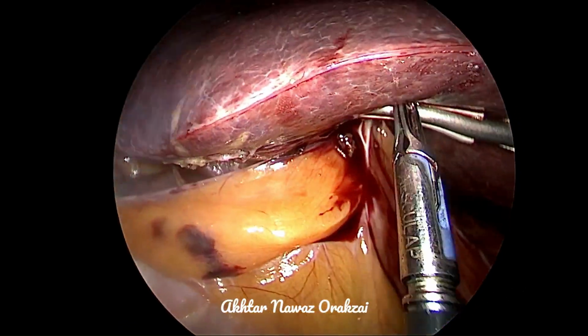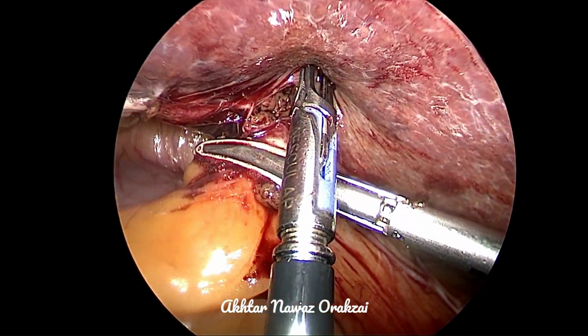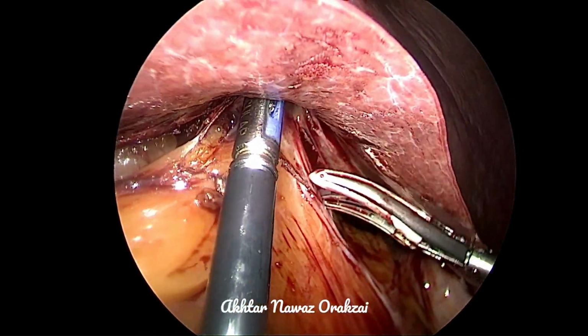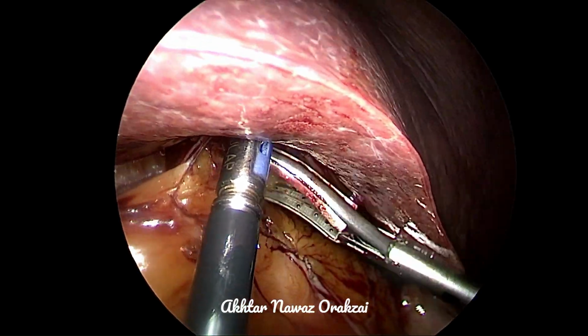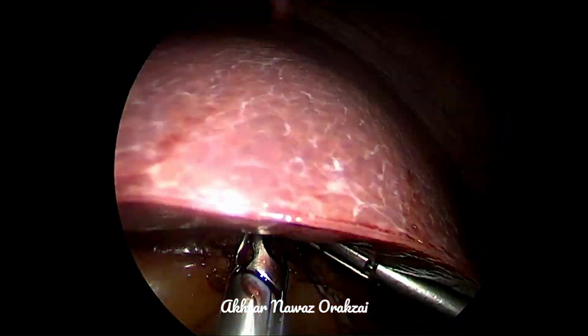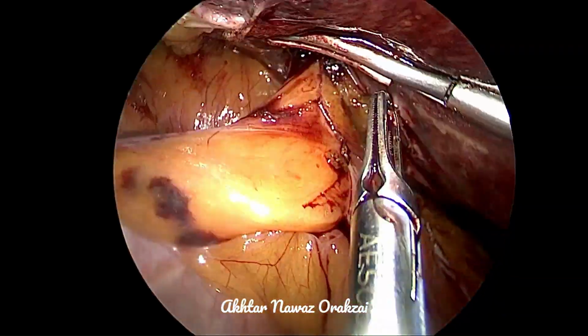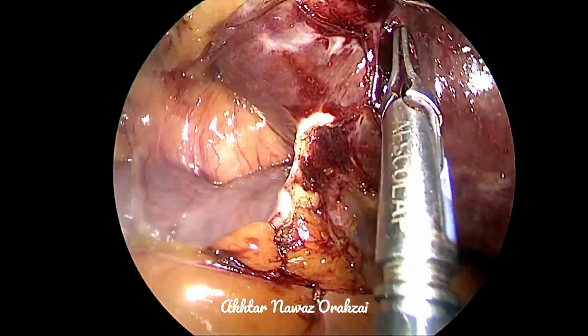However, it is a magnified view. That's why the bleeding seems to be more, but it is not significant, and it can stop spontaneously. So we keep on dissecting and separating the colon from the inferior surface of the liver.